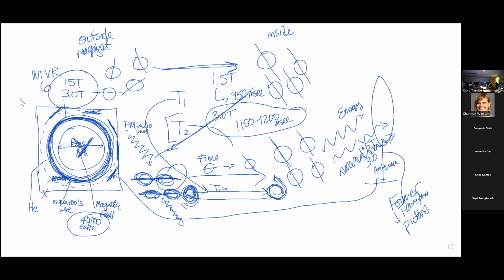But the winding and unwinding process is different. And that's the T1 time. And at 3T, there's a tighter winding. What that means is, it's like a spring, and then it unwinds with a lot more energy, and you get a lot more signal. So you can see more of the effects on those protons than you do at 1.5. Okay? Everybody got it? Any questions on that part?